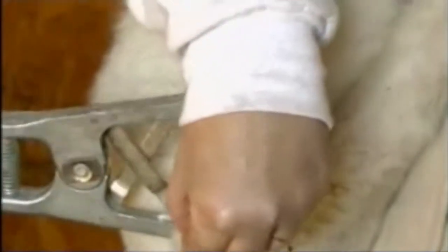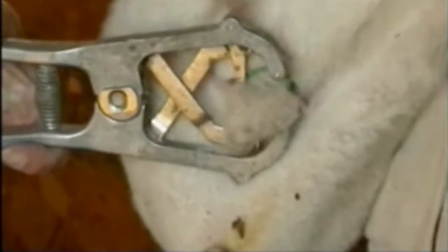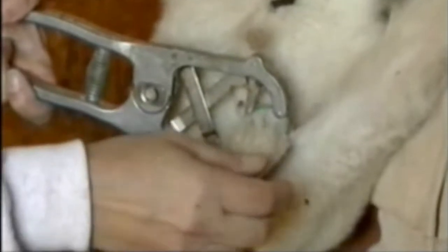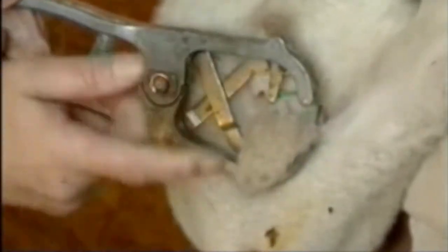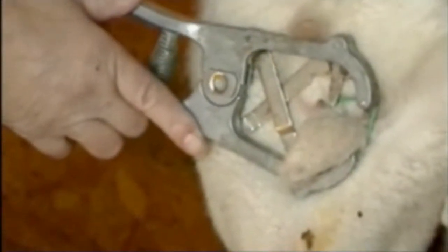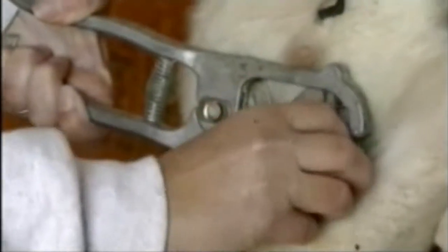We open this up wide like so, and first I pull the whole scrotum through. I don't care whether the testicles are in there yet or not. I want to position it in front of the two teats that are here, like so. And before I close it, I want to make sure that both testicles are in there. I'm pushing up against the body of the lamb, and that helps pull both testicles down.